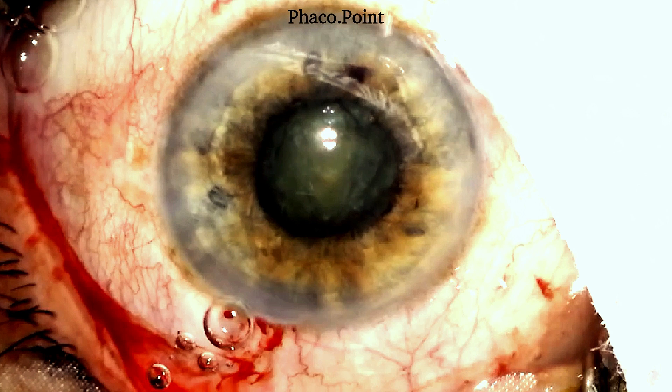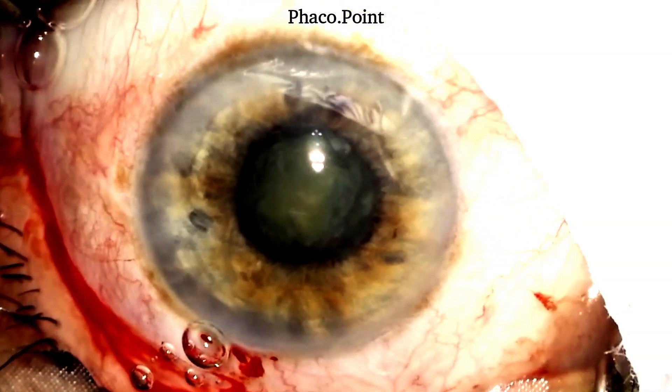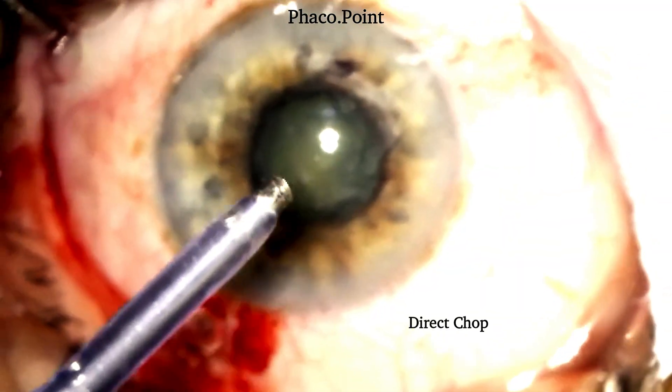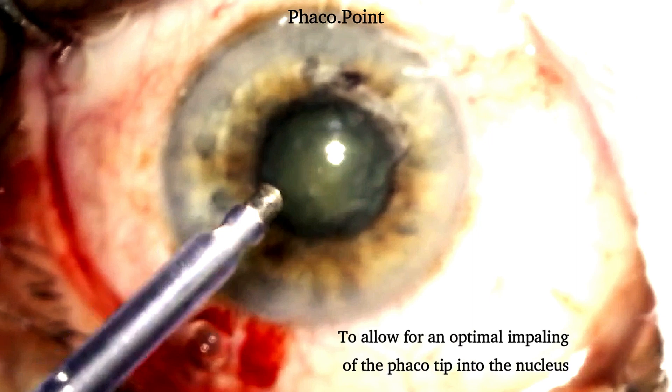Let's watch the surgery and understand the principles of nucleus management in a patient with a small pupil. Whilst attempting nucleus management in a pupil this small, the only technique that's likely to work is the technique of a direct chop. It's important to have adequate exposure of the tip to be able to impale the nucleus adequately.